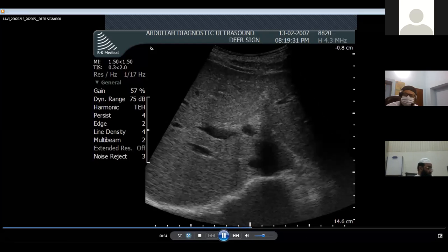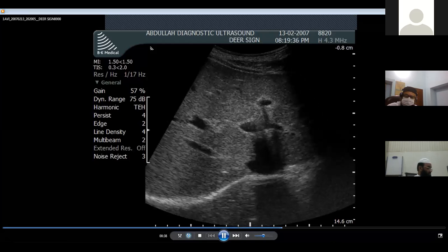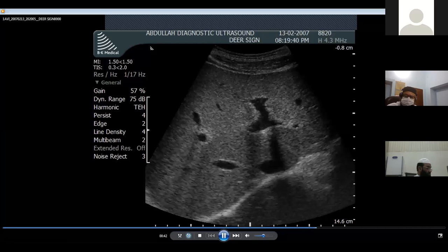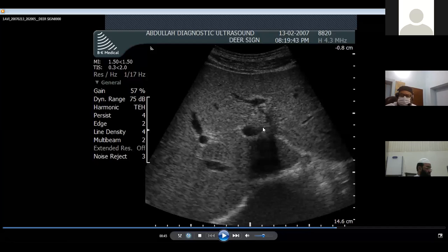This is how we see the different lobes of the liver. Behind the chest, you can see a white line of ligamentum venosum dividing the left lobe from this caudate lobe.